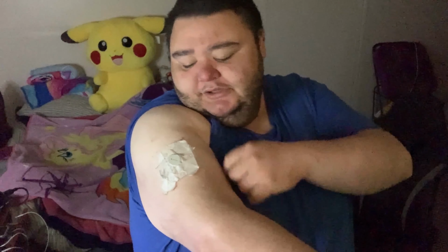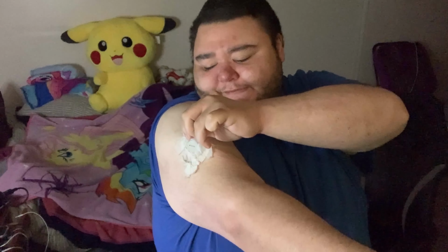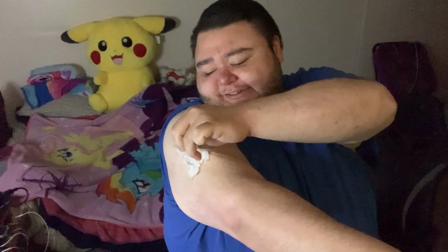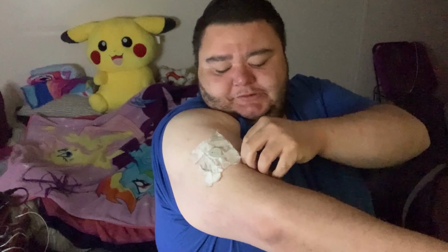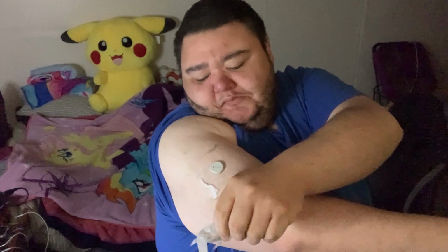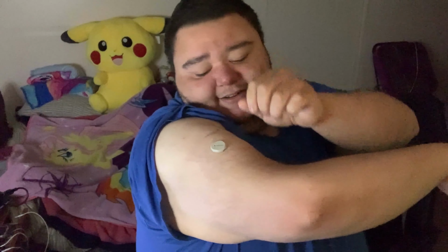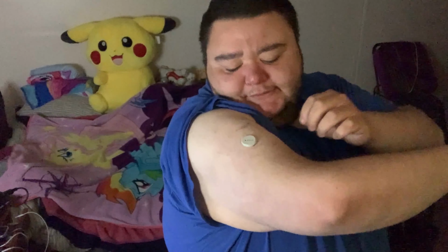And again, I'm going to put the new sensor somewhere else on my body. This is so grody. I'm sorry if you guys see this, but I'm taking this off. It's painful. And I have to clean this area too. There's the sensor, with all the tape. So grody, I'm so sorry. It's supposed to be easy by tearing it off, because last time I yanked it off. So I have to tear it off somehow.